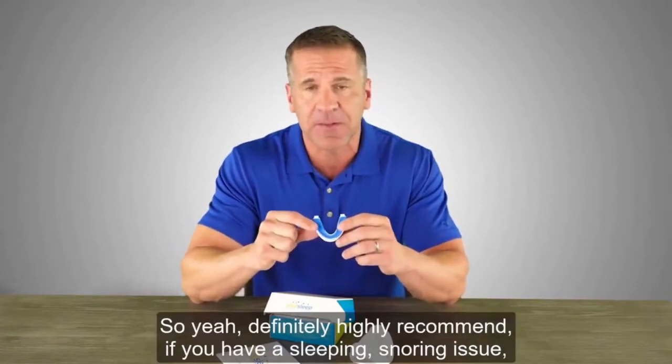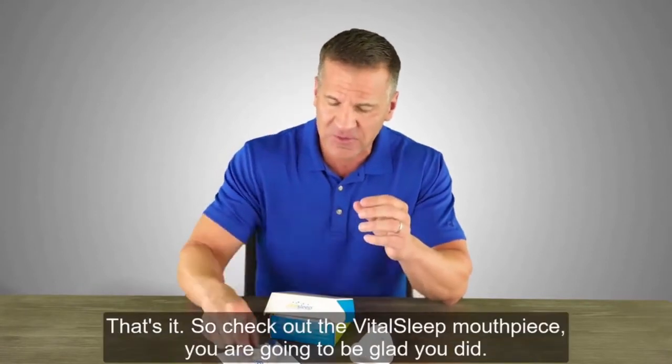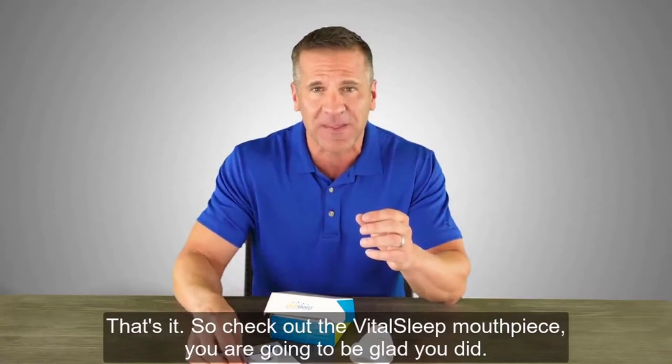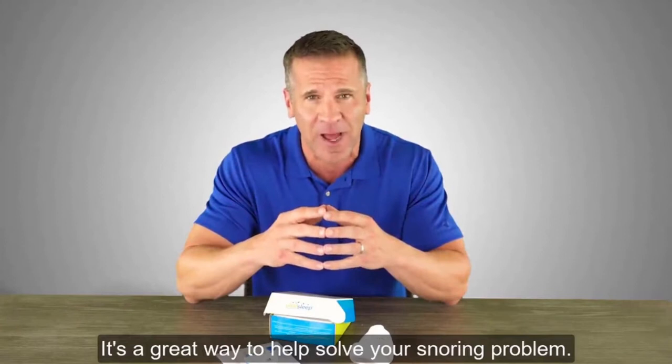I definitely highly recommend this if you have a snoring issue — this is going to help you solve that. Check out the VitalSleep mouthpiece. You are going to be glad you did. It's a great way to help solve your snoring problem.